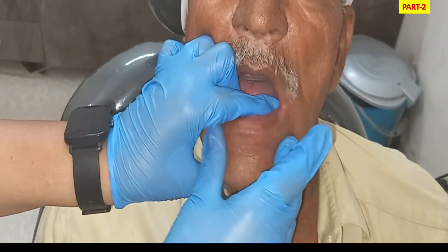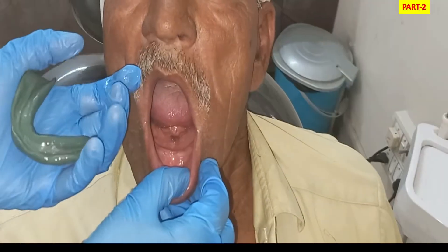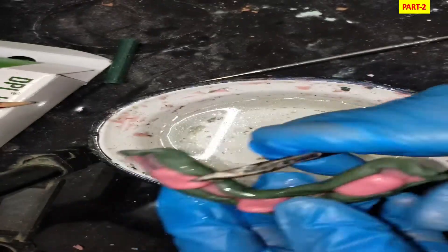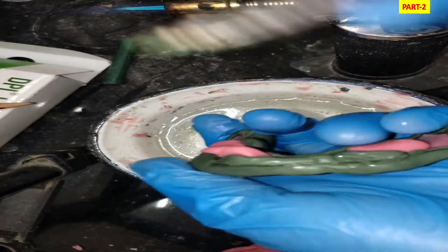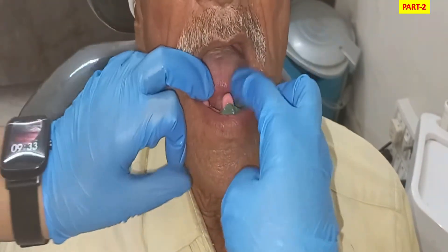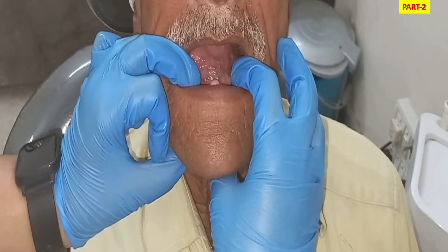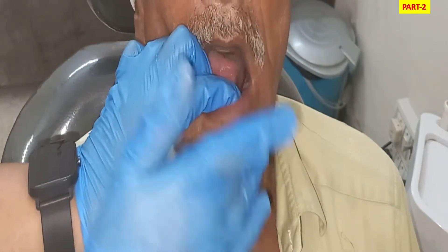We place the tray back in the patient's mouth and perform lip and cheek massage. Buccal and labial borders are recorded by moving the cheek and lips upward and inward to form a seal. After completing all movements, we check whether borders are fully recorded, then remove excess material from the tray using a BP blade so the tray does not dislodge. The tray is then placed back in warm water and reinserted to refine the impression.